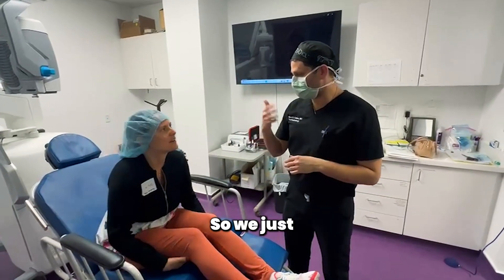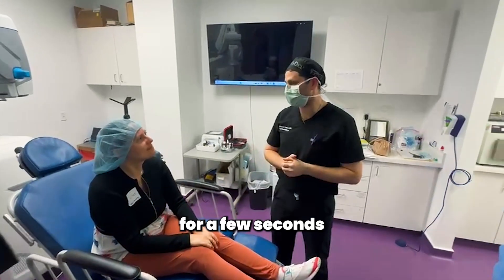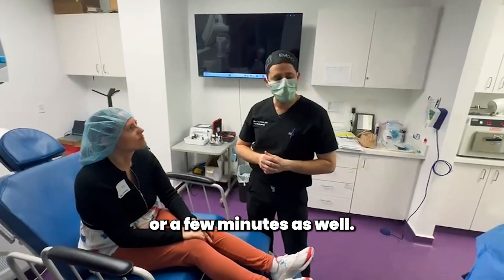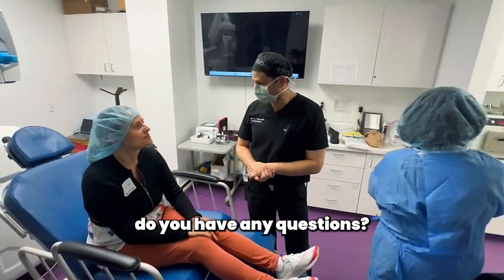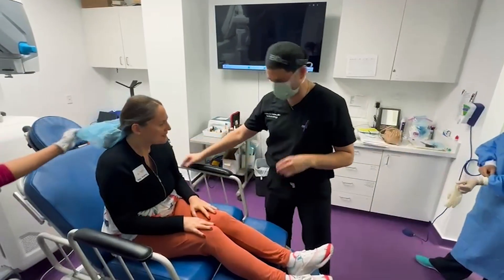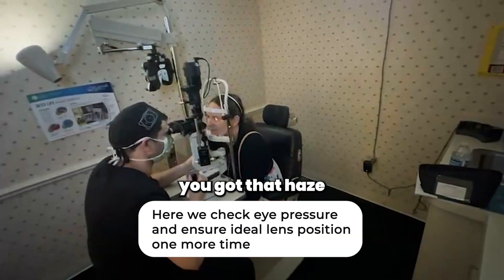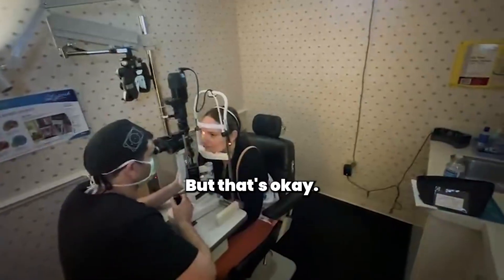We put a little extra sterilizing drops in each eye, and it might stay in for a minute or two as well. Do you have any questions? Great. We'll see you in a few minutes. You have a lot of dryness here, so that's why you feel that way. But that's okay. Looking good.